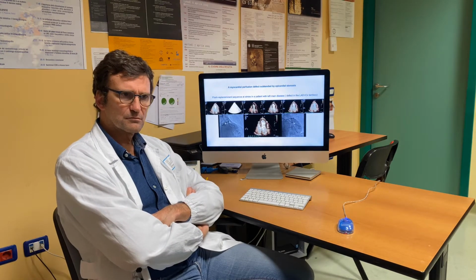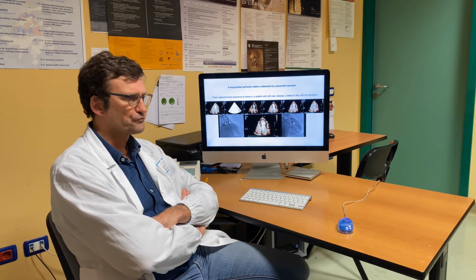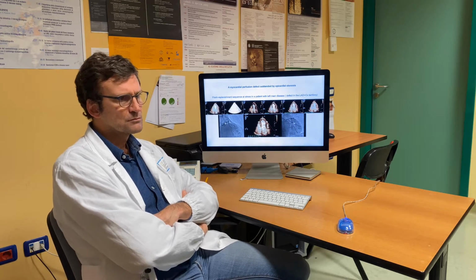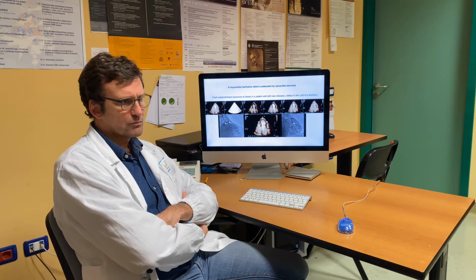Okay, another parameter is myocardial perfusion. We all know that there are many methods to detect perfusion, for example CMR, SPECT, and so on. So why should we detect perfusion with stress echo, and how do we do that?